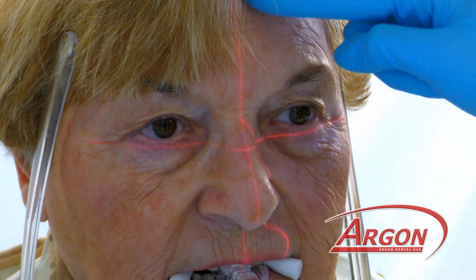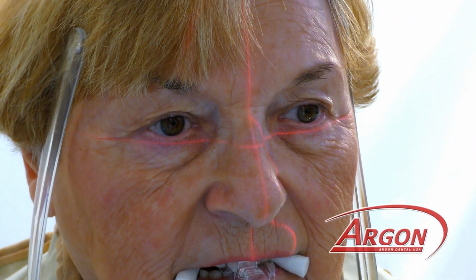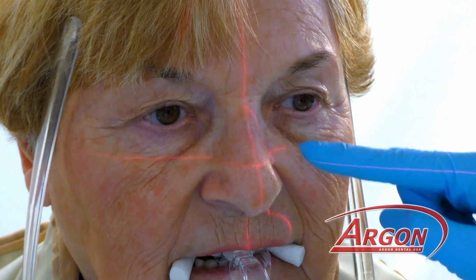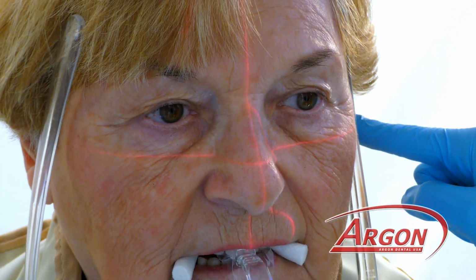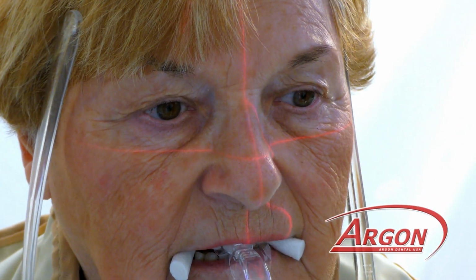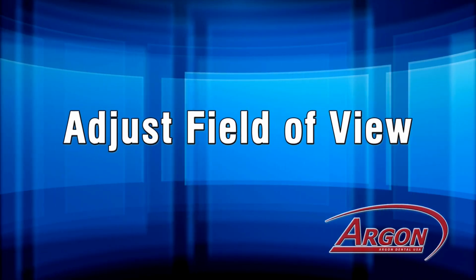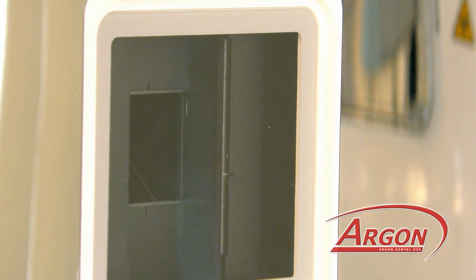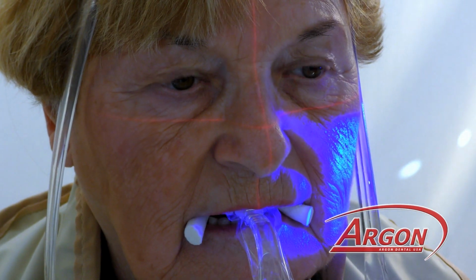Paying attention to the mid-sagittal plane laser and the Frankfurt horizontal plane laser, matching from the tragus to the bottom of the orbital socket. We will again adjust the field of view. In this situation, we are going to use again a 13x10 CT scan.